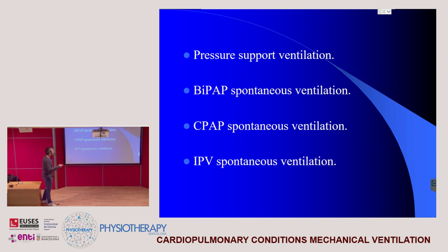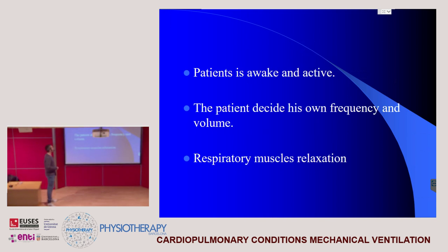So the two most important spontaneous modes are pressure support ventilation and also BPAP spontaneous ventilation.